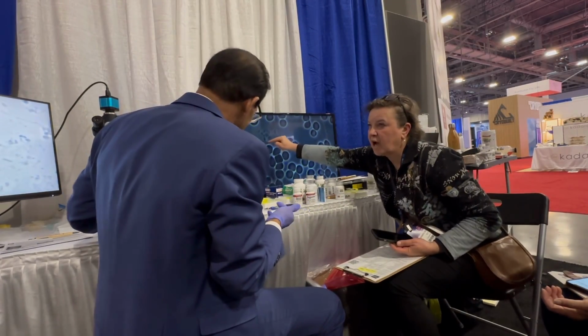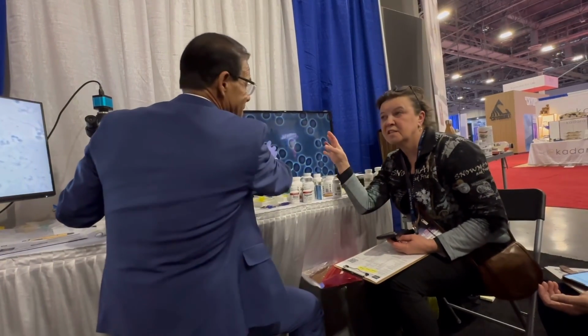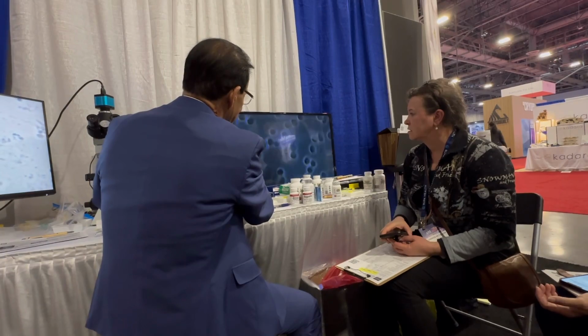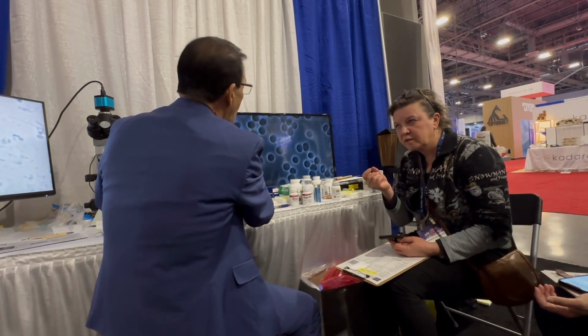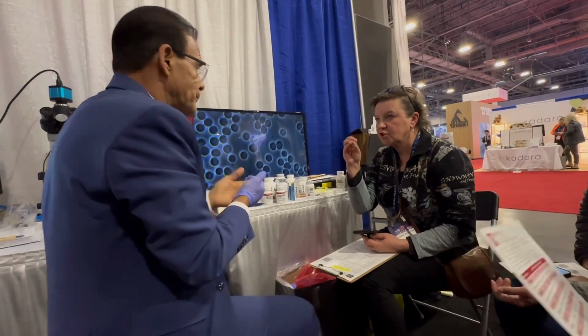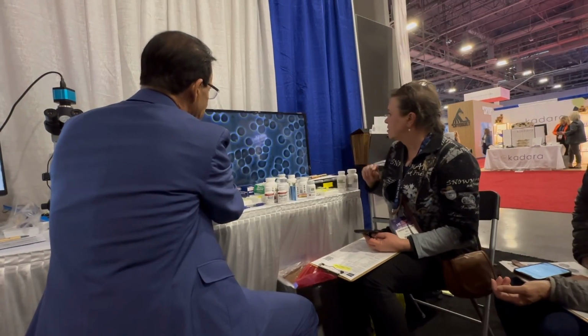That thing is a platelet? Yes. But they're smaller than that, no? They can be very expansive. Cluster of platelets? Yes. Because I know they're smaller. Individual platelets are very small, but then they start agglutinating. They start to stick to each other. Same there.